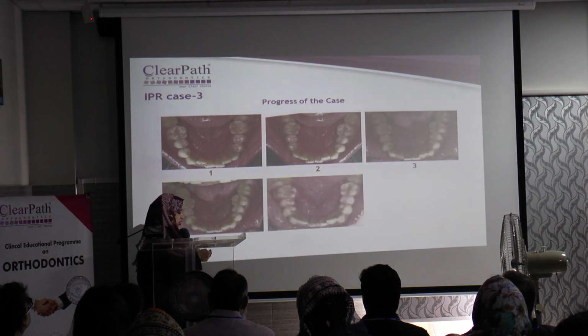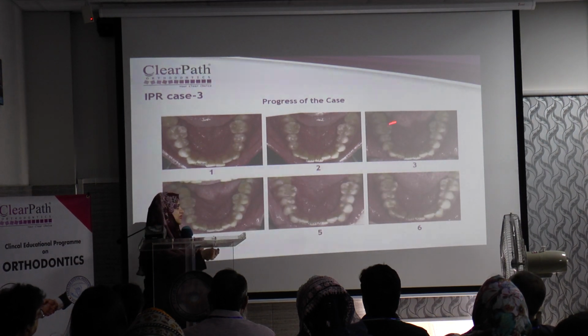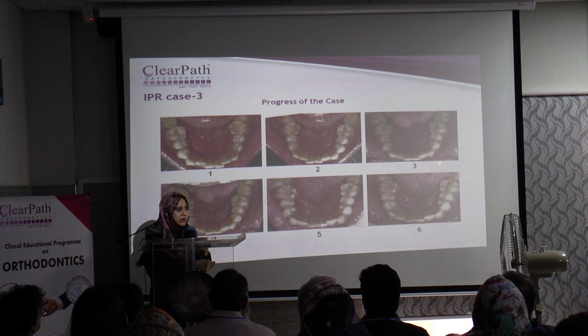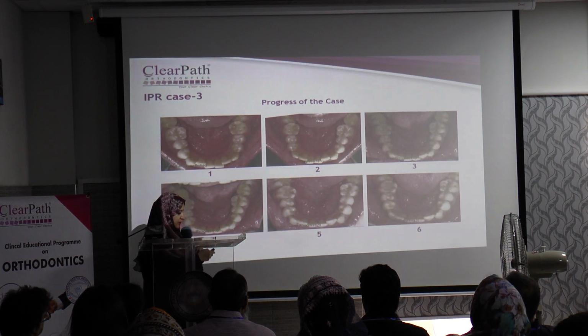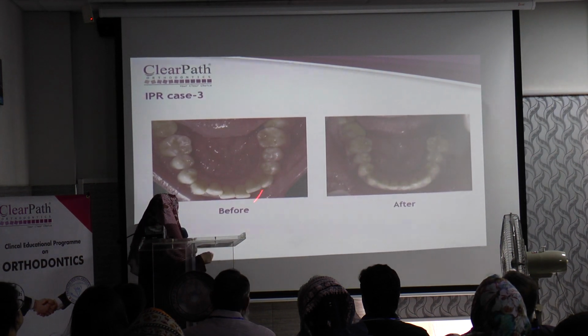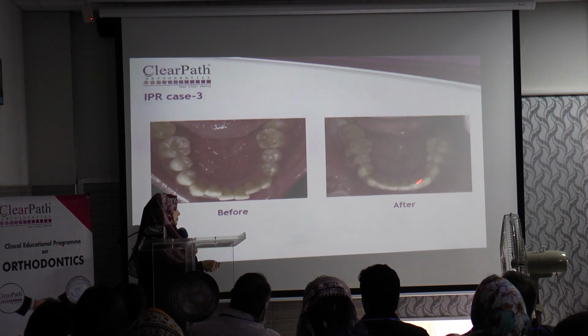Okay. So this was the progress of the case, step by step. This is how we get the aligners. We incorporate the movement in each and every step. Very light continuous forces. Okay. Another case of the IPR. Before and after.